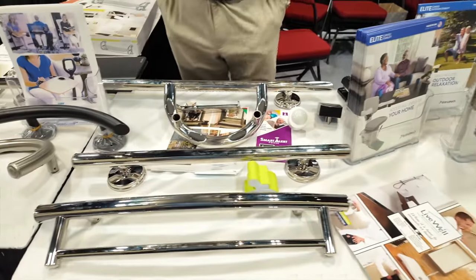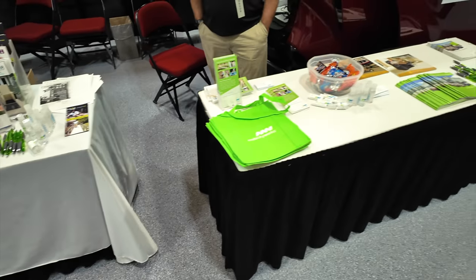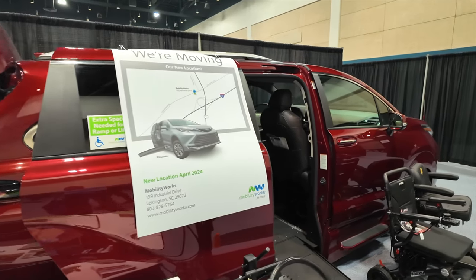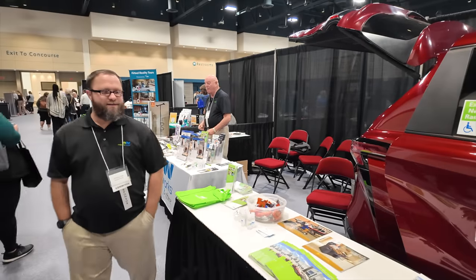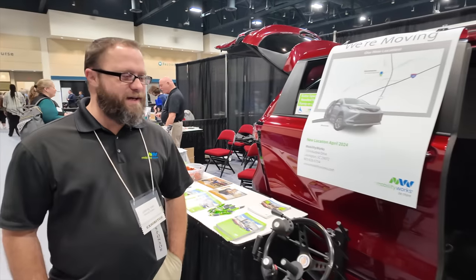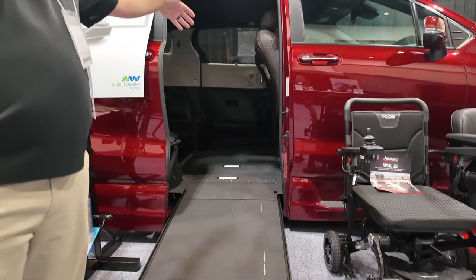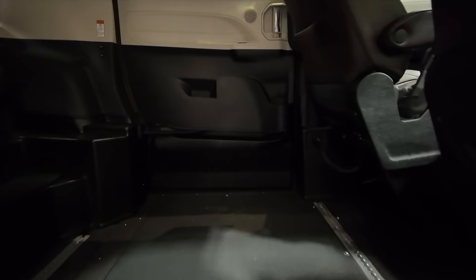And there you go. And you said we got this brand new van sitting over here. Yeah, I got a brand new van. How we doing? Doing well. What can you tell me about this marvelous piece of machinery here? So we take a regular minivan and we convert it so that wheelchairs or scooters can actually go in. This one is an in floor, so the ramp actually goes inside the flooring. And the vehicle kneels down to help with that incline.